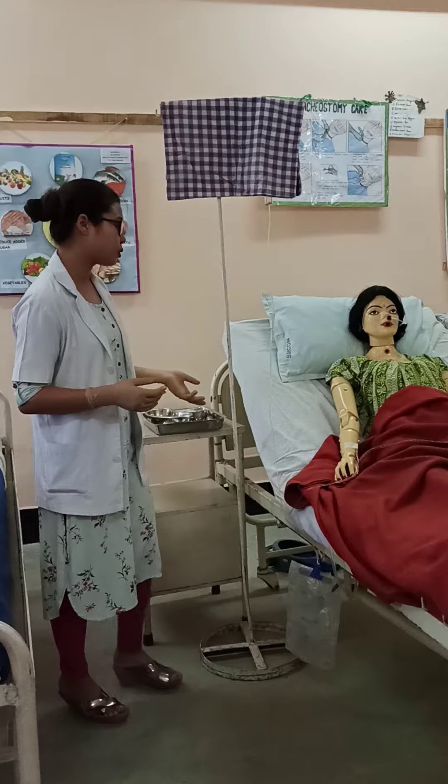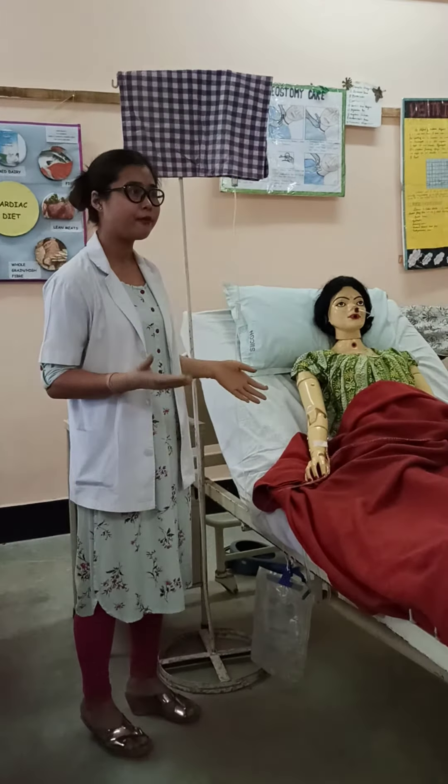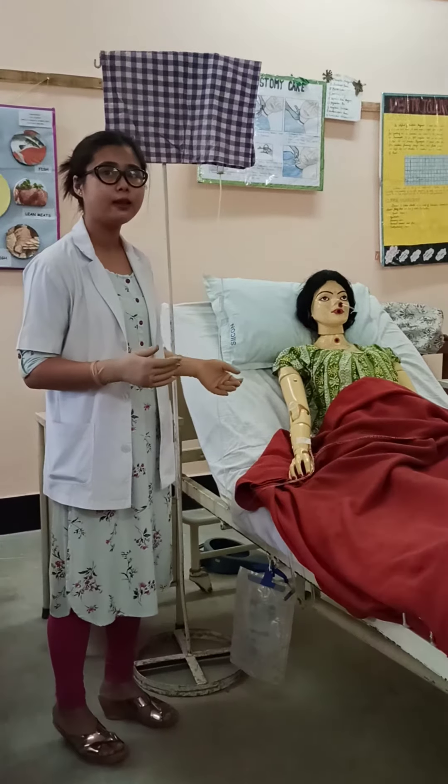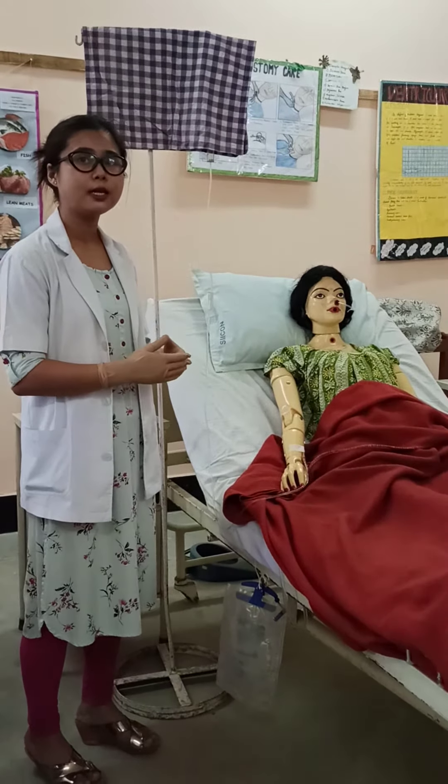During the procedure, check the vital signs for the first 30 minutes every 15 minutes. And after that, we can check every 30 minutes.